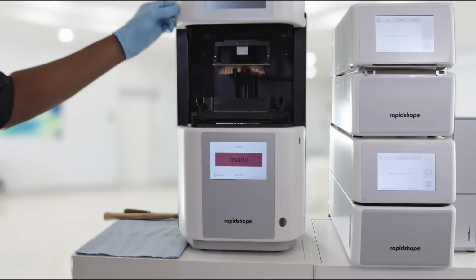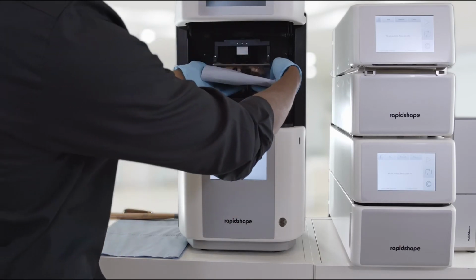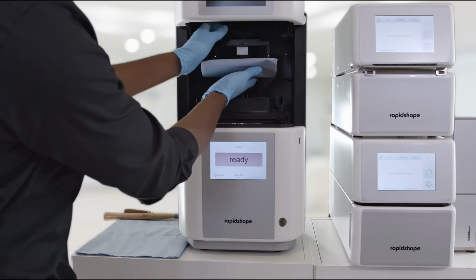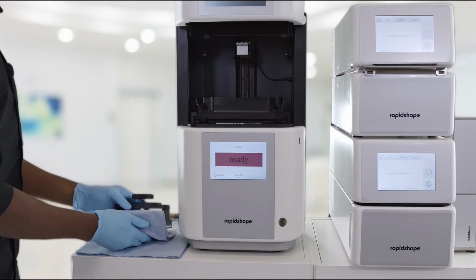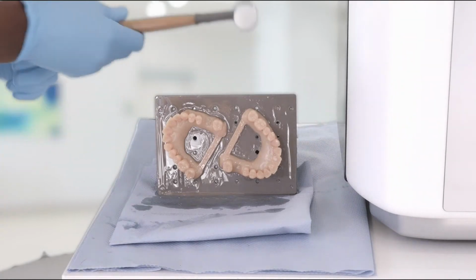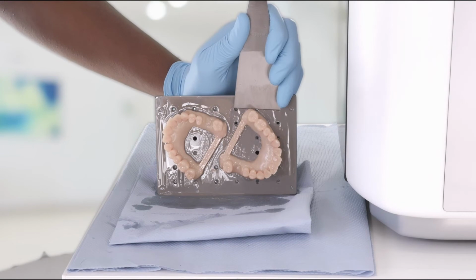You can now open the hood after the job is finished. Take a paper towel and place it under the job. Unscrew the build platform and remove the platform from the printer. You can now take a hammer and a spatula and remove the models from the platform.